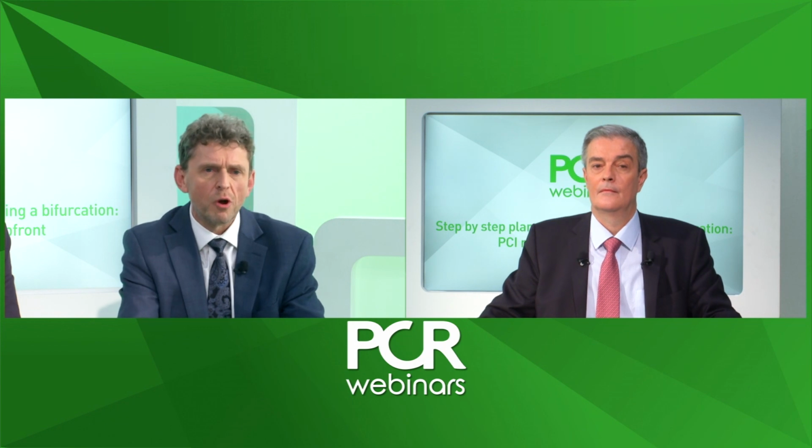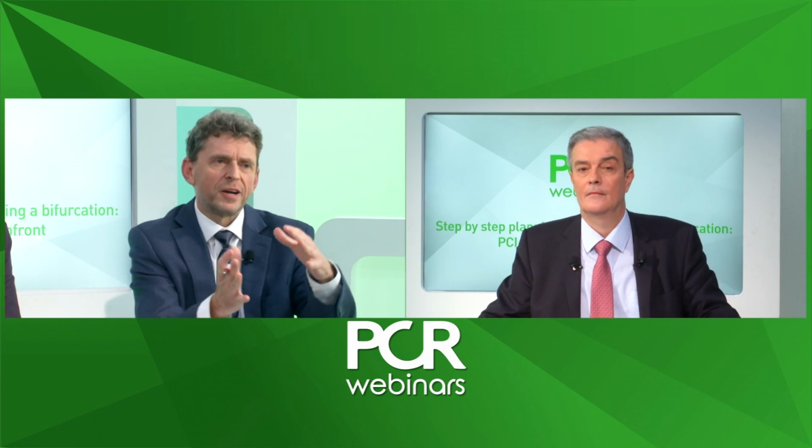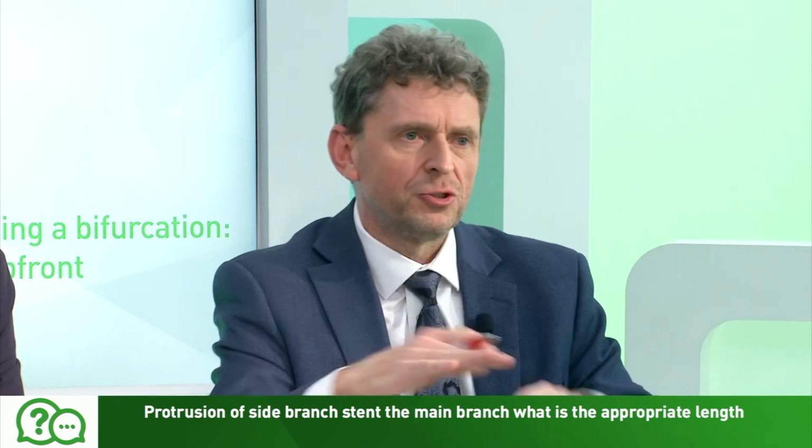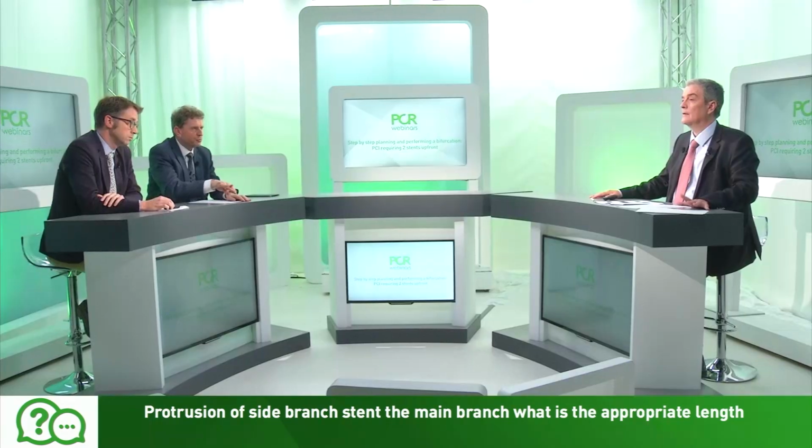So you don't have to cover the long stretch of it. It's a kind of mini DK crush, but of course the whole part of the stent had to protrude into the vessel to leave some space to do the kissing through the struts of the stent.